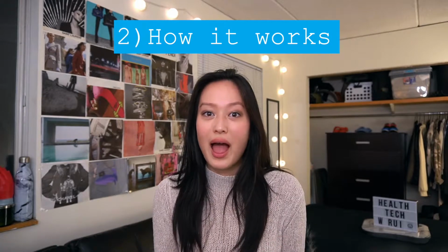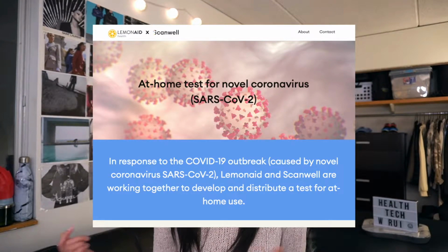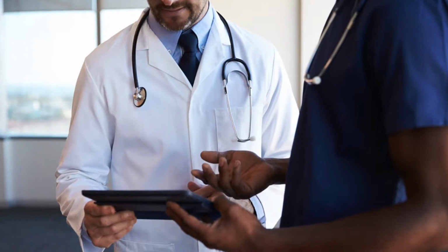So now that we've gone into a little bit of the background of this product, I'll dive into how this test would work. So first, to take the test, you'll just need to complete a questionnaire on the Scanwell Health and Lemonaid website, which will be reviewed by a doctor or a nurse practitioner. This is just to see if there is a need for you to take the test.